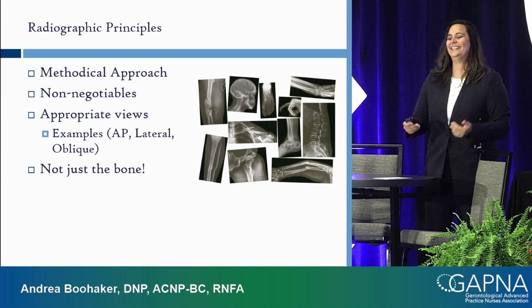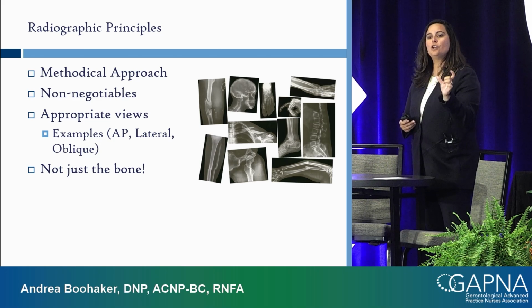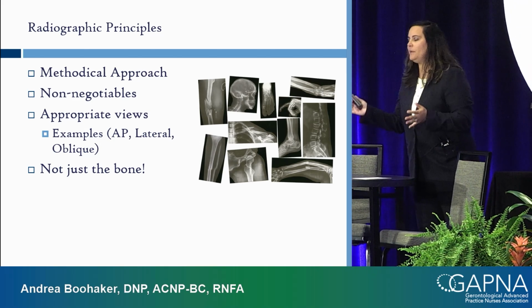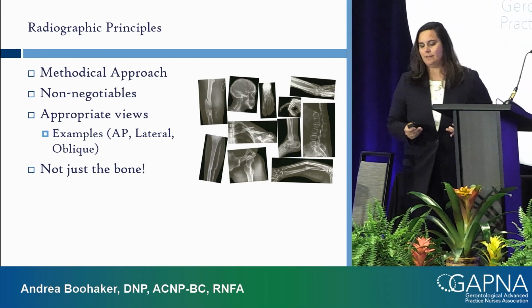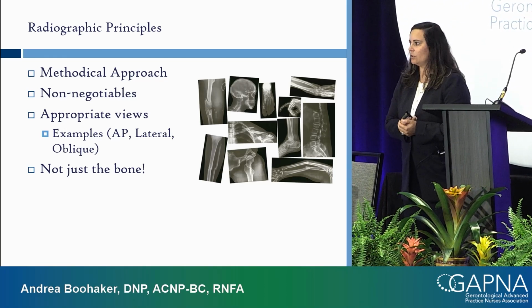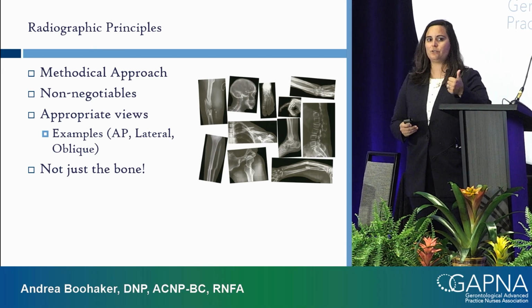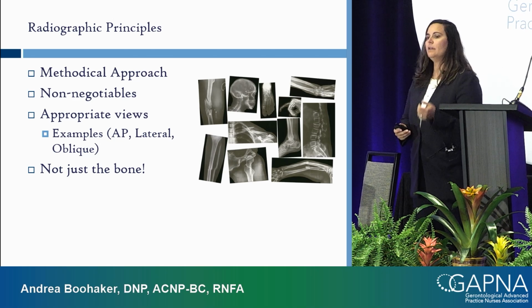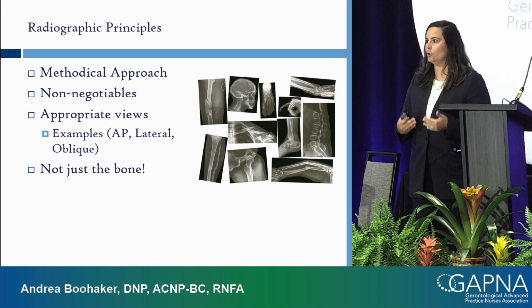Methodical approach. Then you have your non-negotiables, all right? And a little bit of the non-negotiables feeds into the third bullet of appropriate views. If you're in the ER and you're the APP on service and you have a patient that comes in and you're calling, let's say, the orthopedic person that's on call, what's that orthopedic person going to ask when you call? Are there x-rays? What type of x-rays did you get? And what do you see? Okay? Whenever you're trying to diagnose something, you always want to make sure you have the appropriate views.